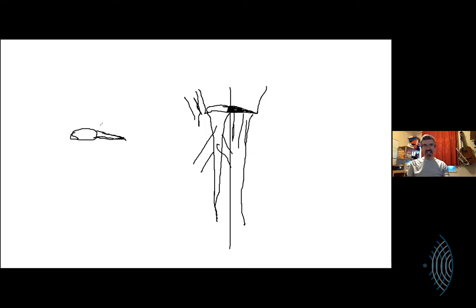And this is why. This bit is there. It then goes thinner, so it's almost a tadpole shape. So as I go in the direction of the infraspinatus interdigitation, it gets thinner. And you'll see on some of these scans, I can always see infraspinatus coming over the top of this. So infraspinatus fits like a glove.